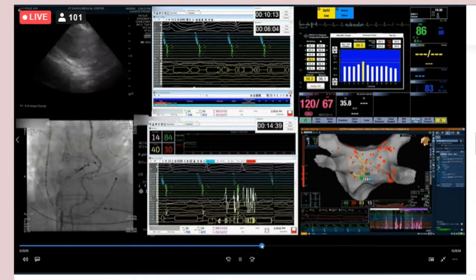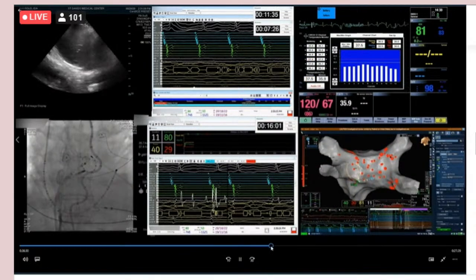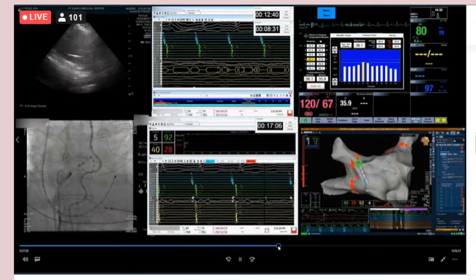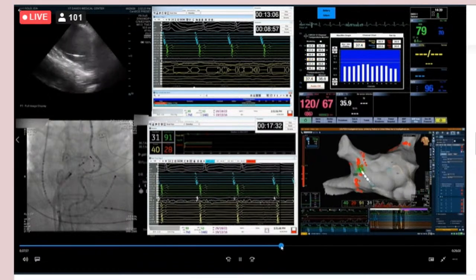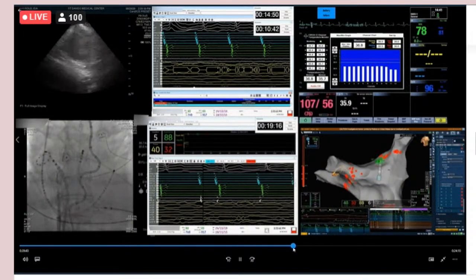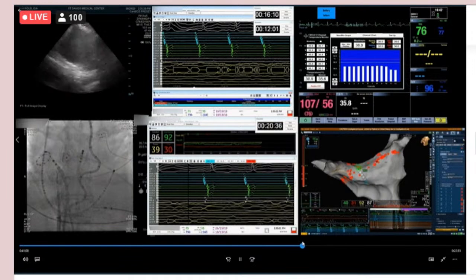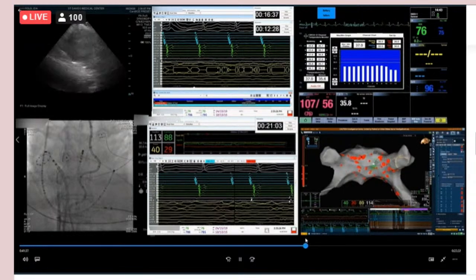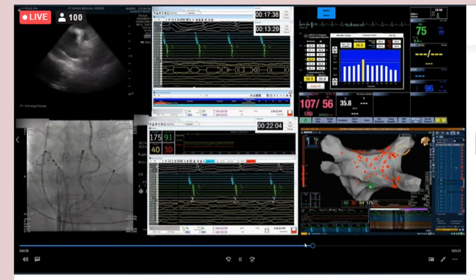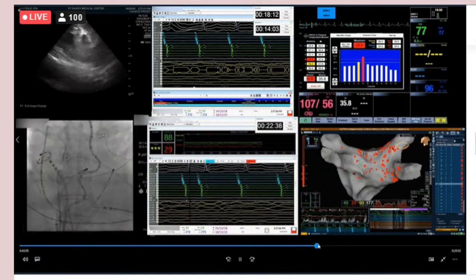So just forward a little more towards the ending of the case. You can see just more lesions to make sure that everything is truly isolated well. And then what we typically do is skip around, in the sense that if you're getting some posterior wall heating, you move anterior or you move further away from the esophagus, because although contiguous lesions would be nice, the problem with that is if you're posterior, it's really hard to do that and still maintain safety. So it's been 20 minutes, and it looks like most of the posterior wall may be gone, although the lasso is not exactly there.